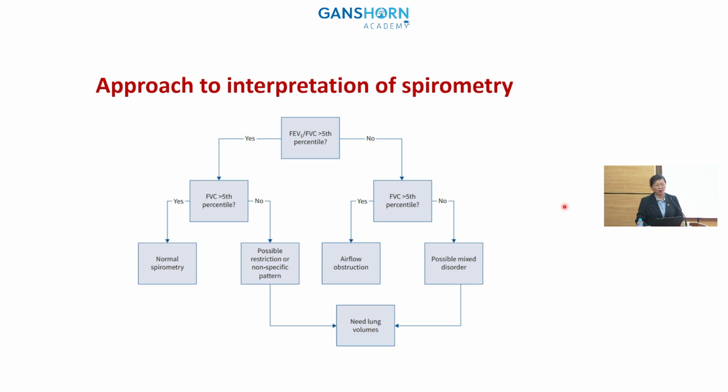But first, you have to choose the right reference equation. For Southeast Asians, we will use the GLI with Southeast Asian, and you see that we will not use any percentage, but the upper limit of normal or lower limit of normal.